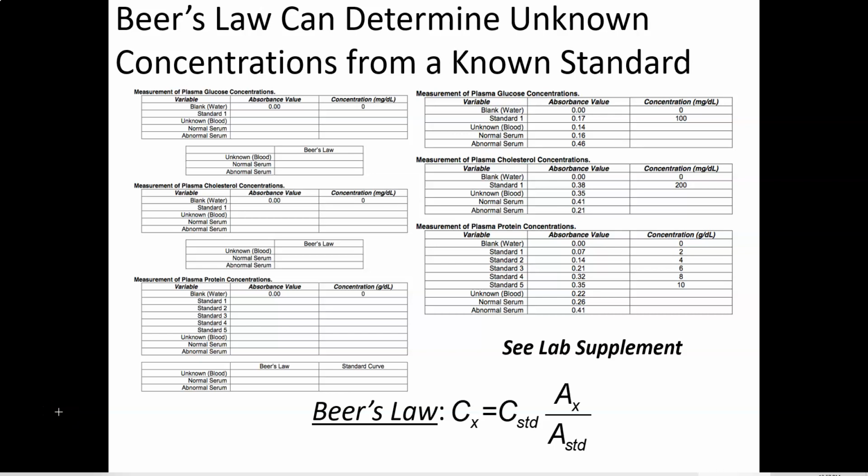So apparently I did not finish the last video, so here's a little addendum to add to that. It ended when I was going to discuss what to do with the cholesterol reading, so it's nice to actually have a fresh screen. So looking at the cholesterol, we can see it right here.